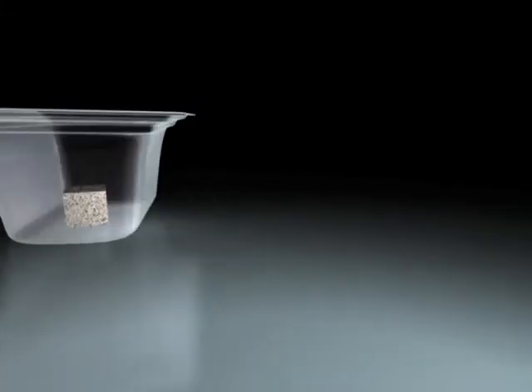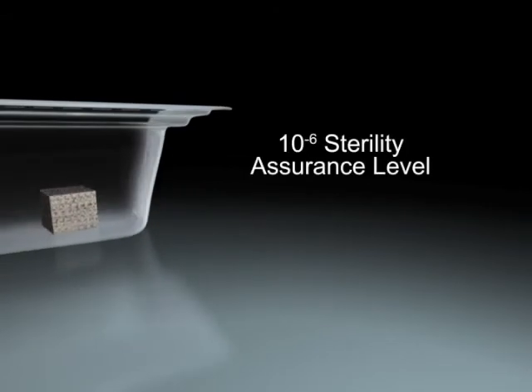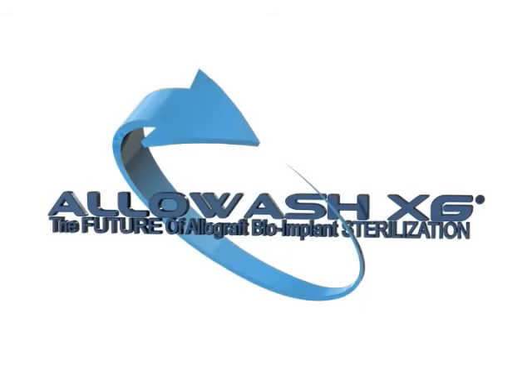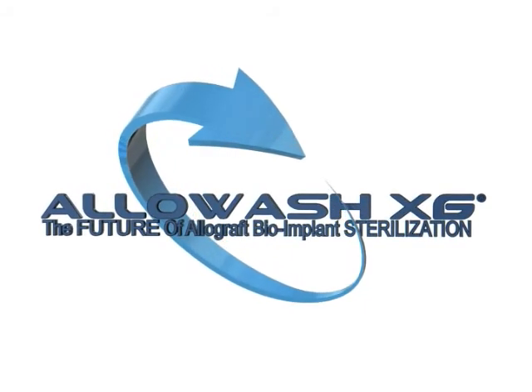Allowash XG technology provides a balance between utmost safety and efficacy in order to achieve the best patient outcome possible. Allowash XG: the future of allograft bioimplant sterilization.